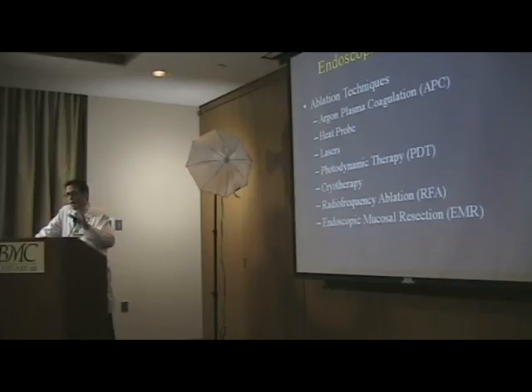So the paradigm shift that I even see now from surgeons is, well, what can you do for me with the scope? And that is very exciting for a gastroenterologist who's interested in sort of the advanced areas that this field has gone into. And I'm going to sort of highlight some of the things that we're doing here at GBMC for this.